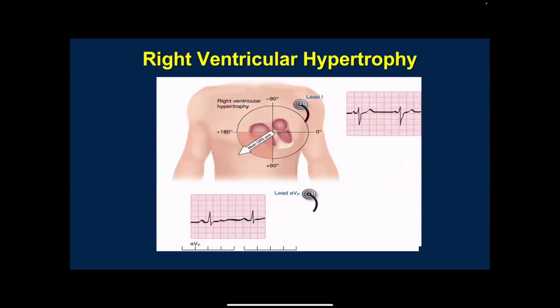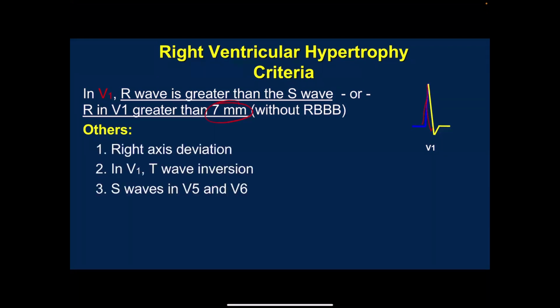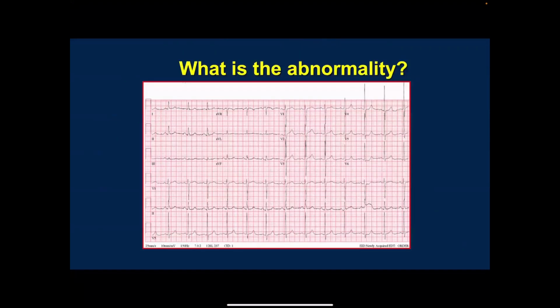Talked about this. Okay, now, how long does it need to be for it to be considered long enough to be hypertrophy? Longer than 7 small squares. That's what you need to remember, okay? The rest, not really important.